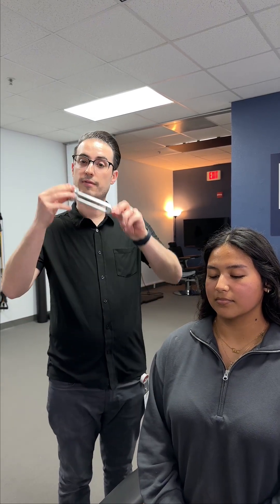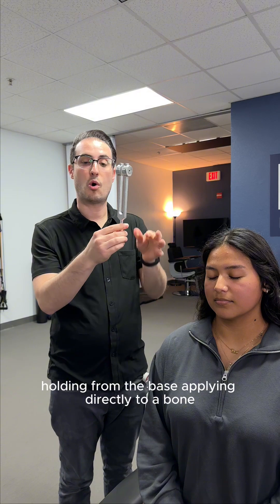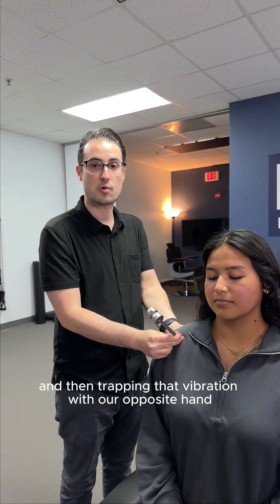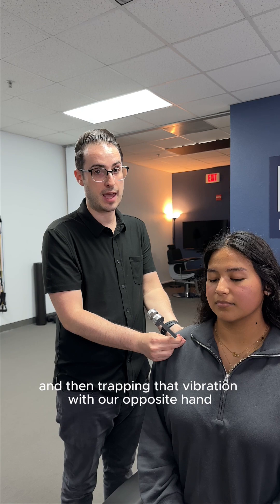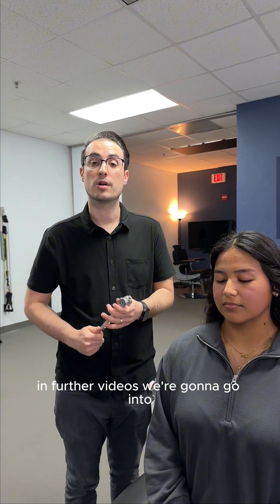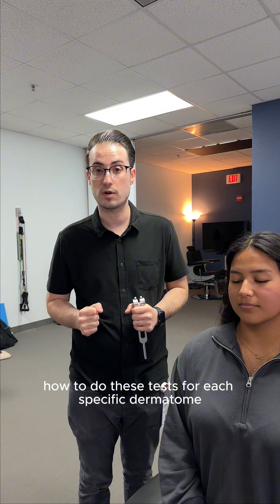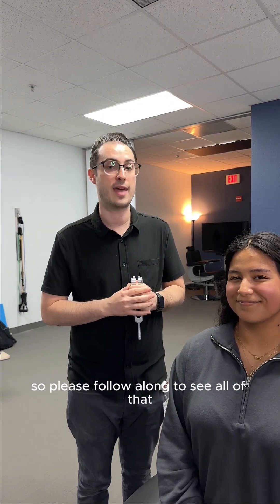To summarize: flick the tuning fork appropriately, hold from the base, apply directly to bone, and trap the vibration with your opposite hand. In further videos, we'll go into specifically how to do these tests for each specific dermatome, so please follow along to see all of that.